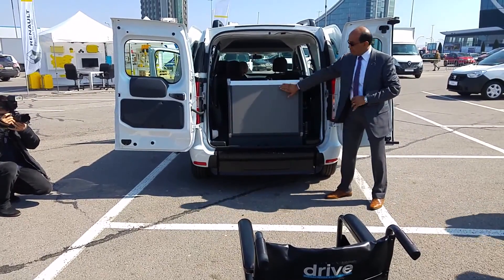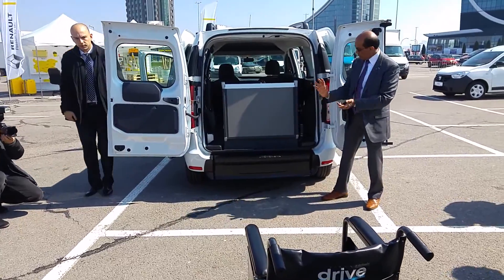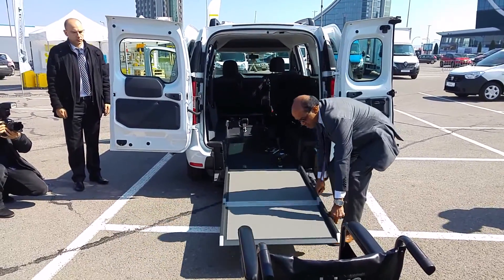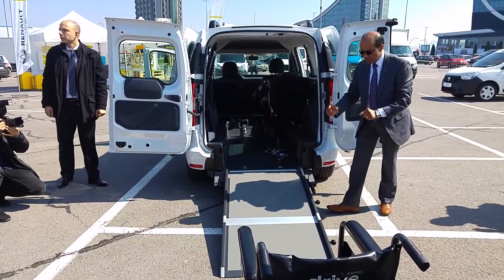So what we have is an anti-slip floor, so you don't slip or slide or anything. So the mechanism, the handle, and it's easy to lift and put away.